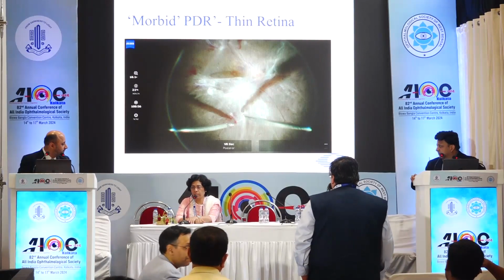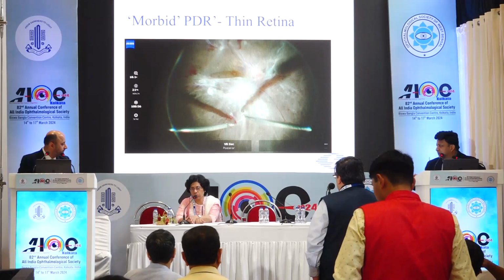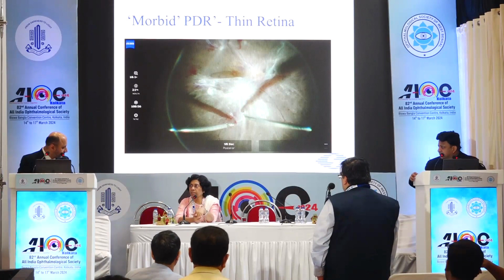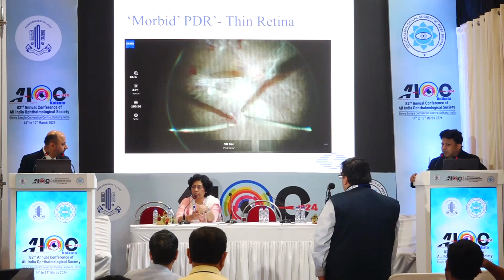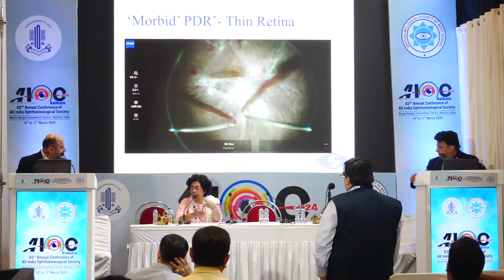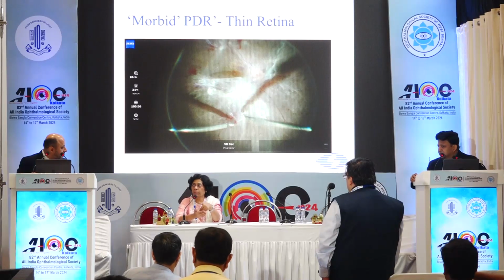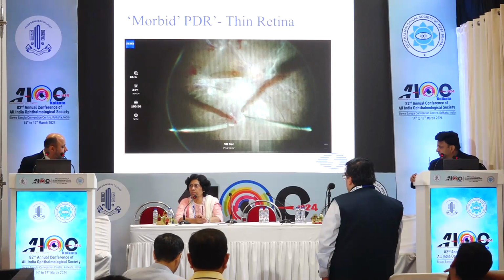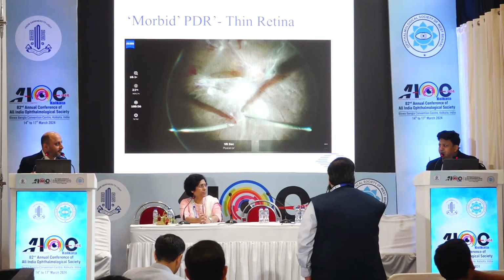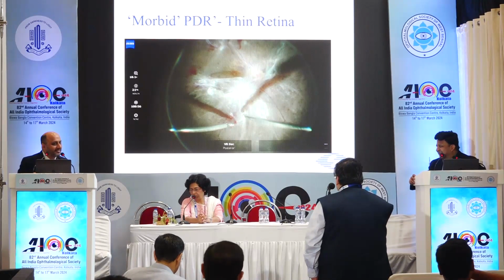But it is very important how the port is directed. The port should definitely be directed away from the retina. And then you can use those techniques described where you keep the cutter, the fold back technique and all those, so that the membrane gets cut and the retina is spared. And also now there is a gap between the port and the cutter tip, and it is also a bevel tip, so it can go easily in between the retina and the membrane. So some amount of retinal safety is there, unlike the 20 gauge cutters, which were so difficult. I had one more video, but because of the time I could not show it. In that video we had discussed all these things.